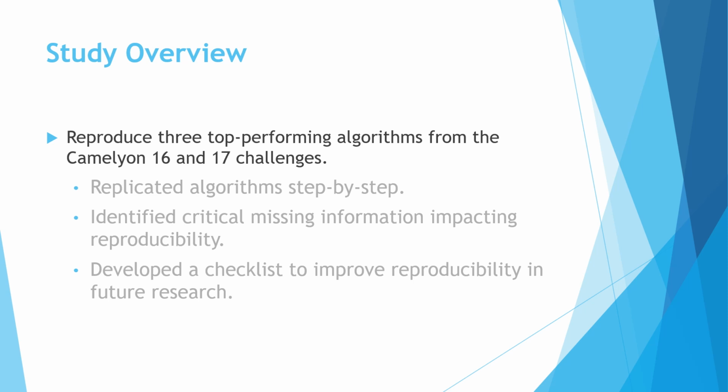And by going through this procedure, they were able to identify some critical missing information that impact the reproducibility. And based on those observations, they developed a checklist to improve reproducibility in any future research that is similar to these papers.